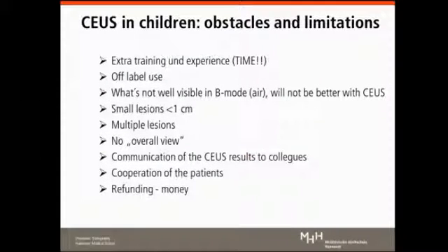So I want to conclude: CEUS in children has really some obstacles and limitations. If you start, you really need extra training and experience. This means time. It's still off-label use in Europe, and what's not well visible in the B mode, for example air, will not be better with the contrast. Small lesions are a problem because it's difficult to characterize them, but this is the same for all imaging modalities.